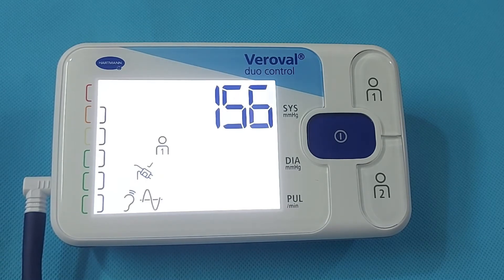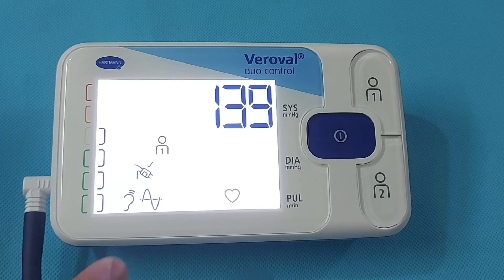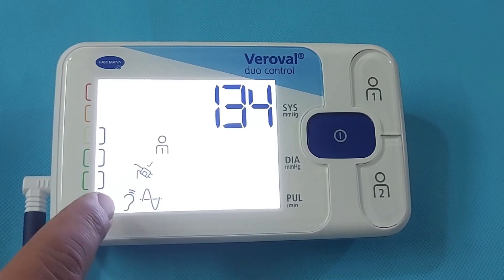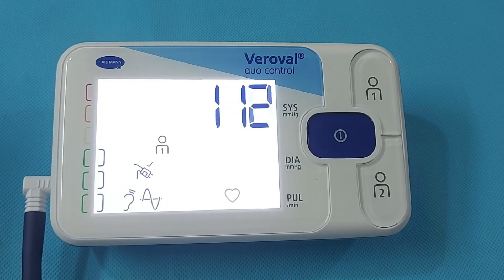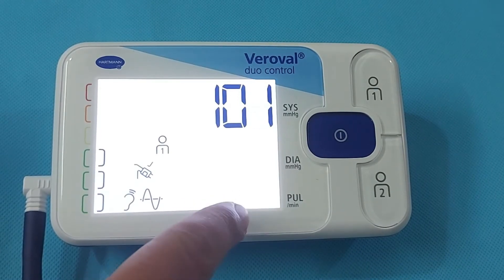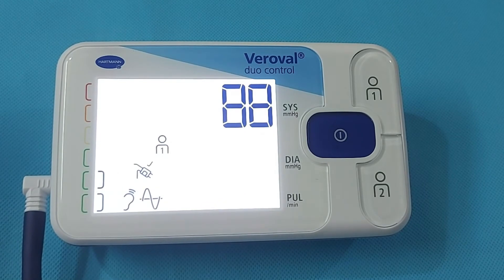A key function of the Variable Duo Control is its Korotkoff microphone and oscillometric measurements, because this blood pressure monitor combines both of these standard methods of blood pressure measuring. The monitor also detects irregular heartbeats and will display a heart shape symbol. If your heartbeat is normal, it will not show the heart symbol.